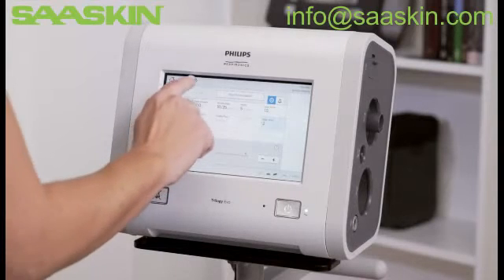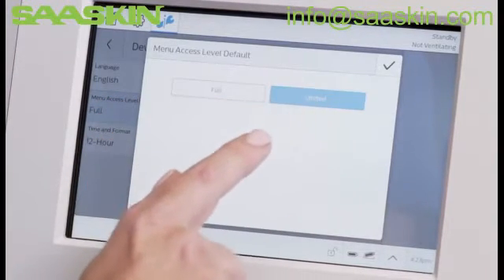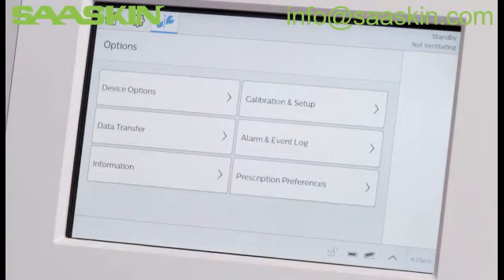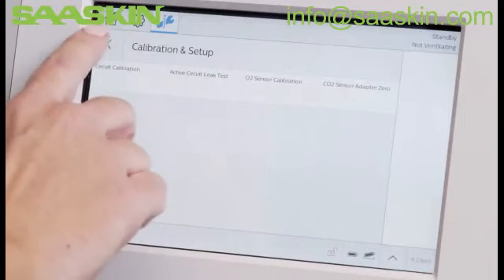Options, which contains Preferences and Other Choices, is next. You can change the menu access level between Full and Limited. Use Data Transfer for USB data downloads and software upgrades. Information provides device details such as current software. Calibration Setup contains O2 and CO2 sensor calibrations, among others.